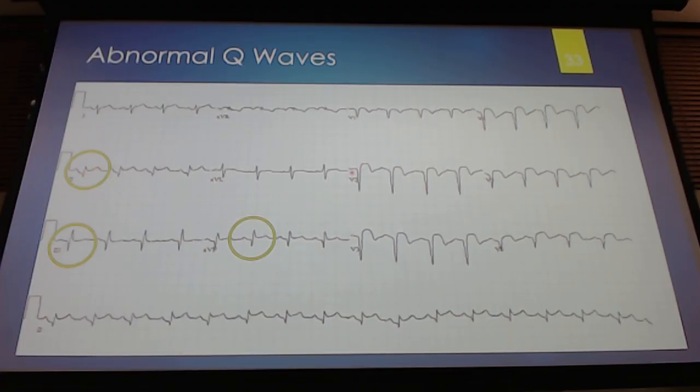Okay, let's look over here. We've got our P wave here, we've got our PR segment, and we've got this round hump right here. Is the ST segment typically rounded, or is it typically flat? Because if it's rounded, that means we still have electrical activity occurring, and that's concerning. This person's actually having an active MI.